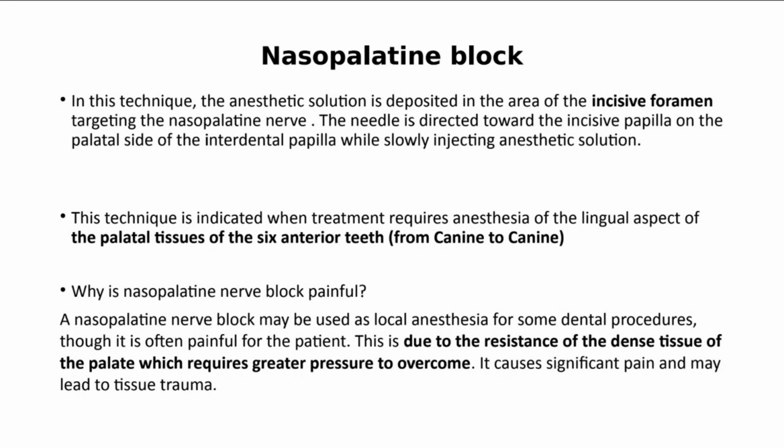So you need to tell your patient, I'm sorry, it's going to be painful, but it will just take a second or two. Always give your patients a heads up to expect. Don't just inject and the patient will scream or something. Always tell the patient what you're going to do before you do it, not while or after.